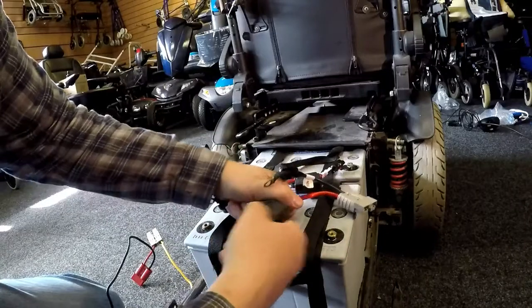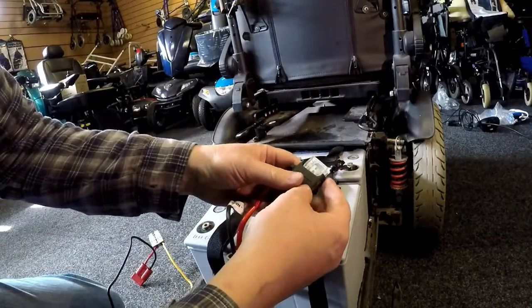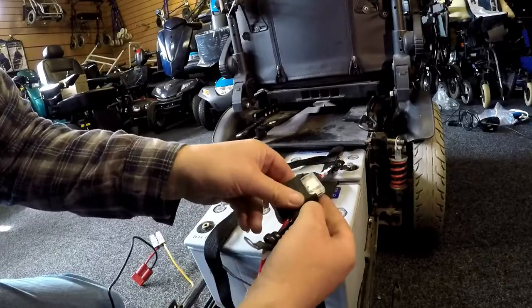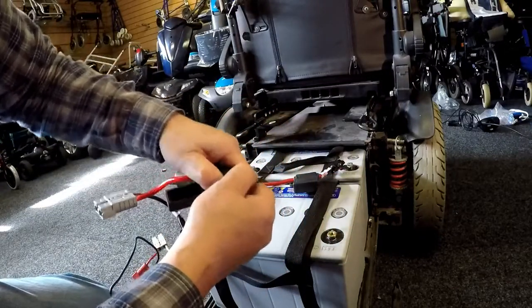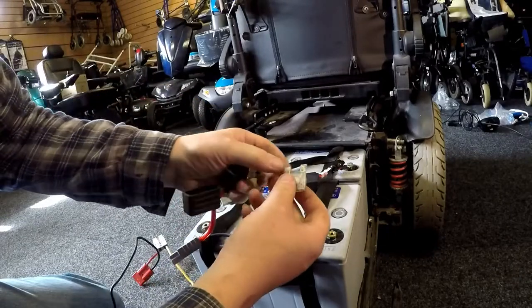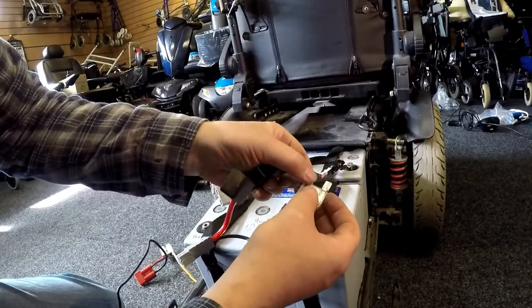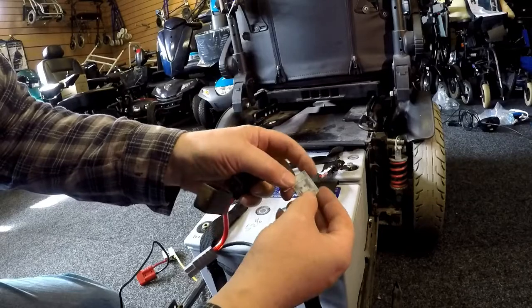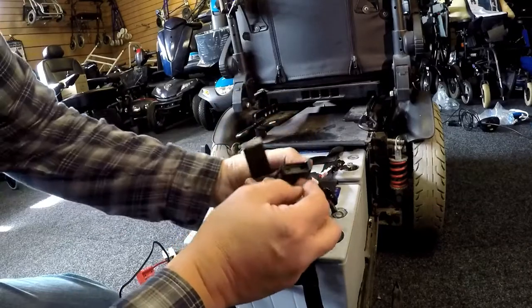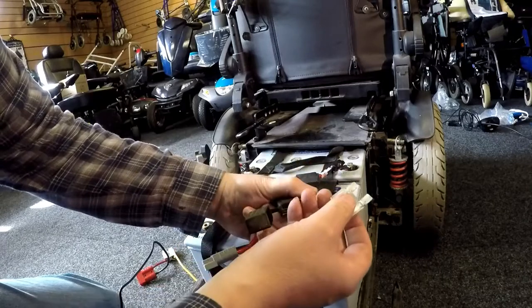So what do you see here? Corrosion. Well there you go — that's the problem there. Can you see all that corrosion? See that side, there's nothing on that. It's not blown — it must have got water in there at some point. Yeah, that's your problem.